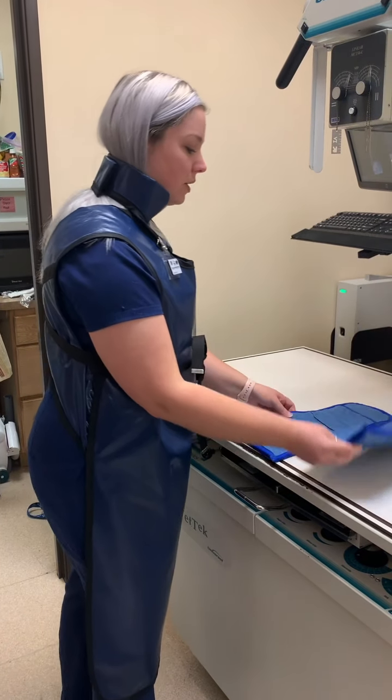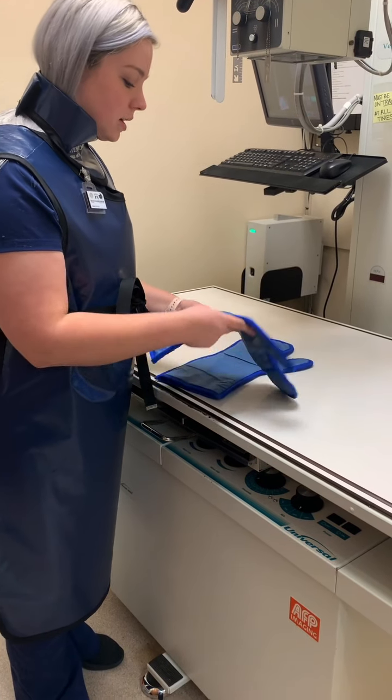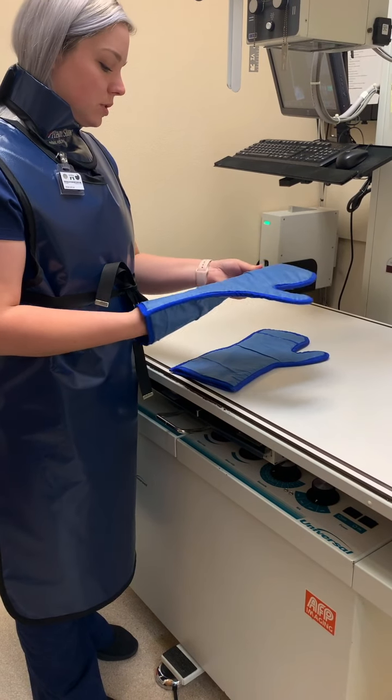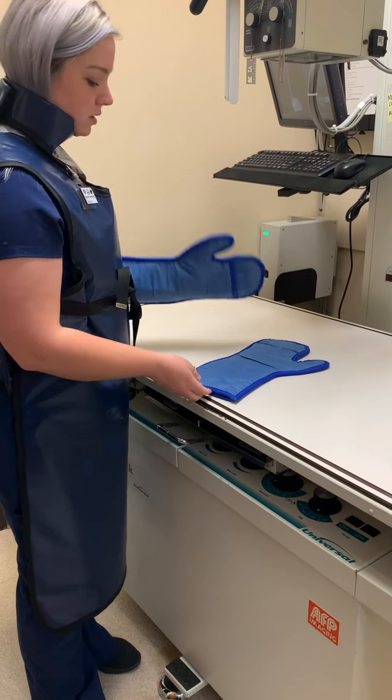And we have gloves, lead gloves, but you really have to check these because patients can bite them and leave holes in them, so you want to make sure that there is no holes or tears in them. They look good. We go on like this.